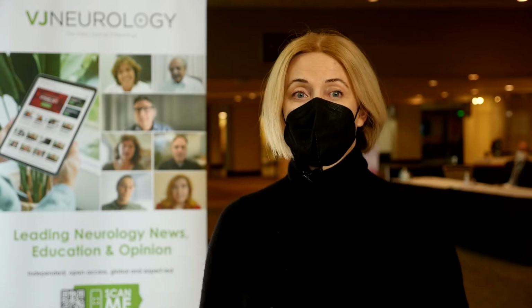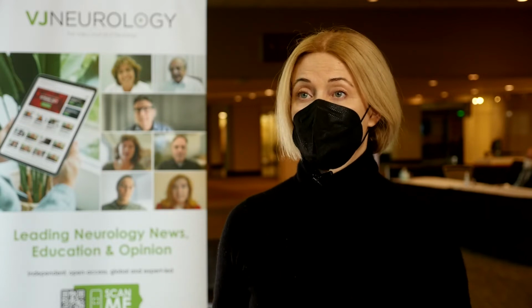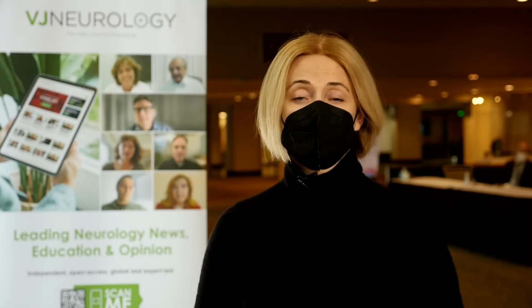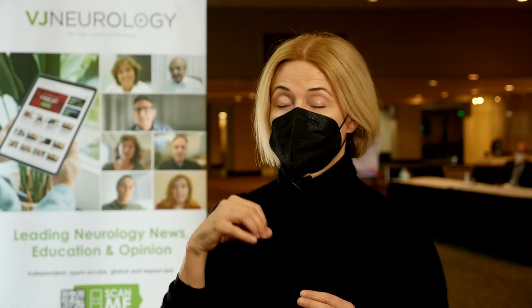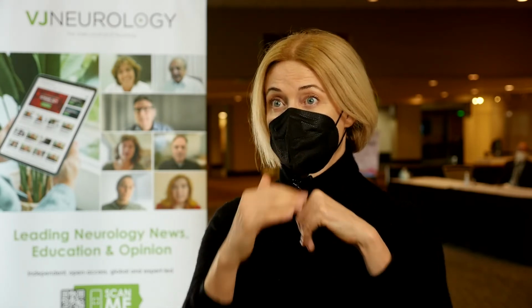And what we found is that the significant effect was much higher at follow-up, at 3 months follow-up, because the people undergoing sham stimulation, which is giving the same type of noise and scalp sensation, that was delivered with a special device which is called H-coil, that has the capability of stimulating deeply below the skull, so to reach the leg motor area representation that lies deeper below the skull.